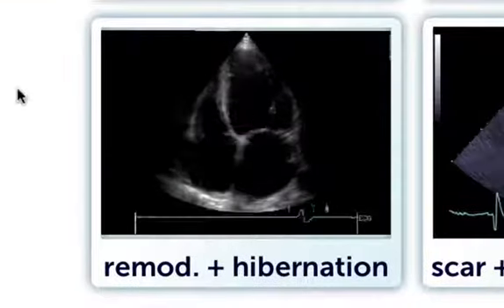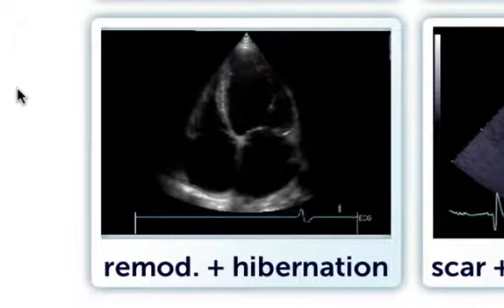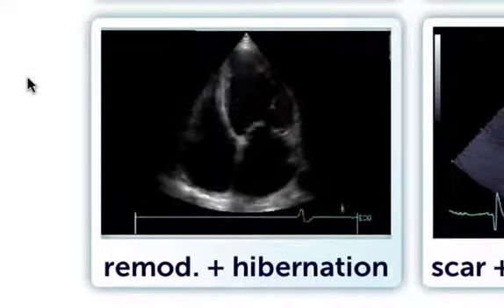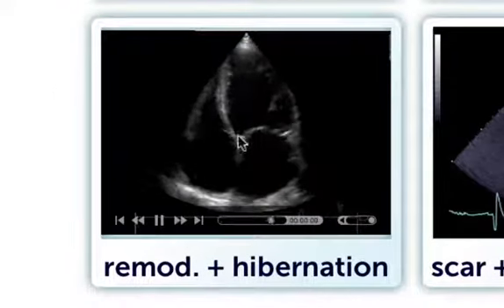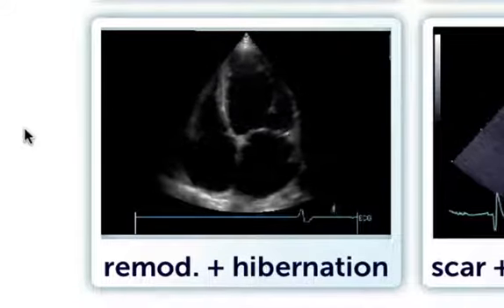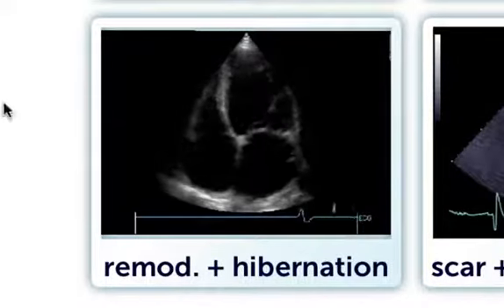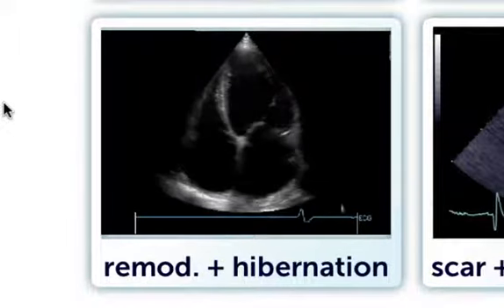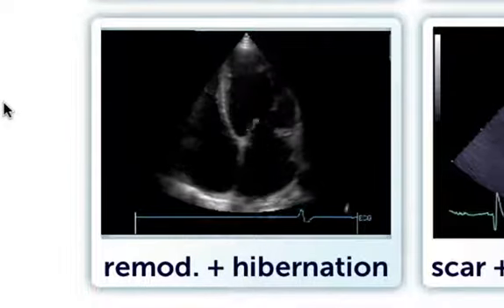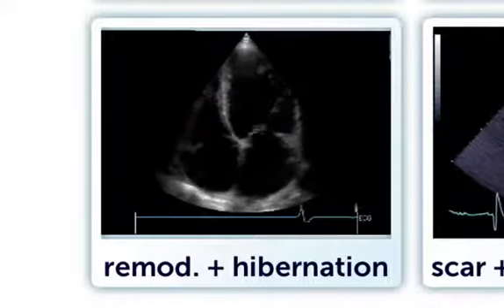This patient here is a patient who had acute coronary syndrome many years ago, but now he presented with dyspnea. Taking a look at the echocardiogram, you will note that the patient has a severely reduced left ventricular function, that the patient has regional wall motion abnormalities, but the function is more diffusely reduced. But interestingly, we can find a normal thickness of the septum. So there is suspicion that the patient has some form of residual myocardial function, viability, and that was documented with other tests, and the patient eventually ended up having coronary bypass surgery, and he benefited significantly. Ventricular function improved after the procedure.